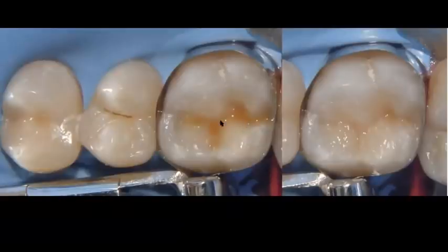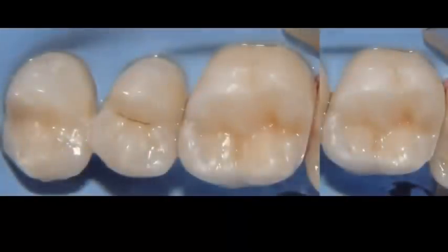So again, we're adding the tint. We add our final layer. You can see we have gone in with a very sharp explorer. And the explorers that I use for this type of occlusal anatomy, I only use for this. I have a set of explorers only for operative dentistry that I use to restore teeth. I don't combine or mix those with the ones that I use to do exams on my patients. I want very sharp and really good quality explorers so that I can get in here and just develop that anatomy with a very fine instrument.